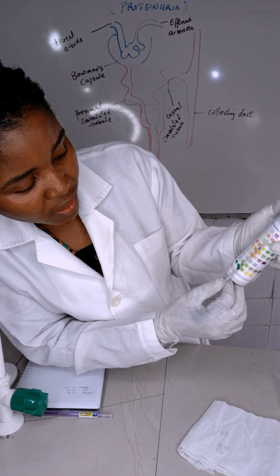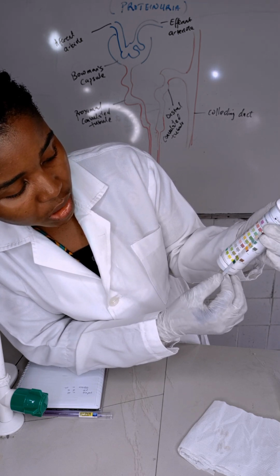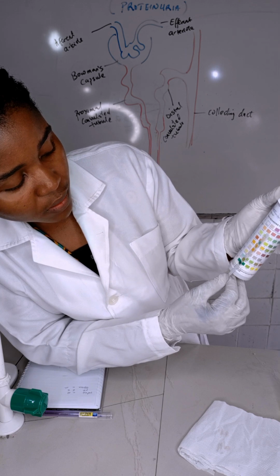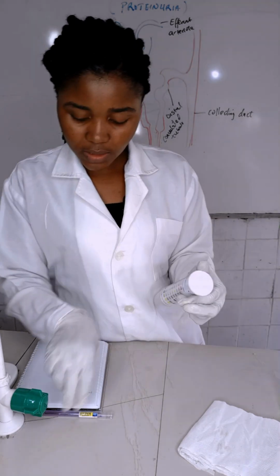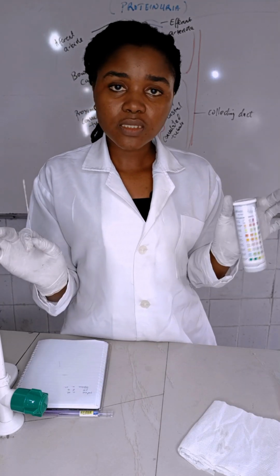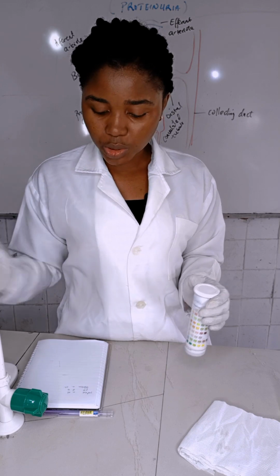You can see that ascorbic acid, there was absolutely no change. It remained bluish green. So I will give ascorbic acid nil. So that is it. That's how you carry out your urinalysis test. You can now discard the strip.